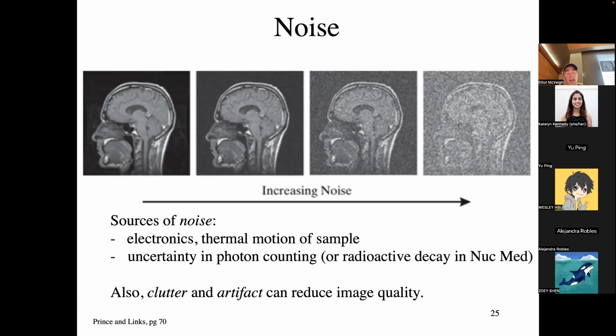The other thing that can happen in imaging is the imaging system itself can produce artifacts. What an artifact is, it's a very coherent signal that you detect as a signal, and it's not random, it's not noise, right? So in CT, a classic artifact is these streaks that go off something that's small and bright, and those streaks aren't noise. They're just like, whoa, where'd those things come from, right? That's not the object.